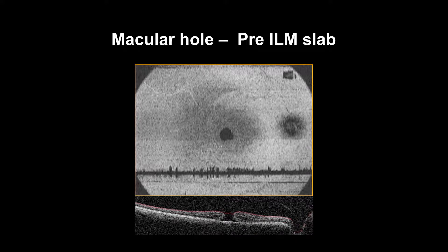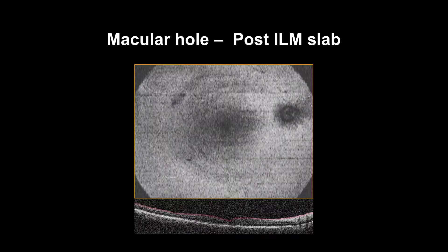The ILM slab pre-surgery shows the macular hole and some blink artifact, while the ILM slab post-surgery shows closed macular hole. One of the main features of the ILM slab post-surgery is concentric macular dark spots due to removing the basement membrane and its end feet, which are in close contact with the RNFL. Those macular spots appear 3 months post-surgery, are permanent, and are not found in areas where ILM is not peeled. Therefore, EnFace OCT can be a non-invasive method to confirm the peeled ILM in emmetropic patients.